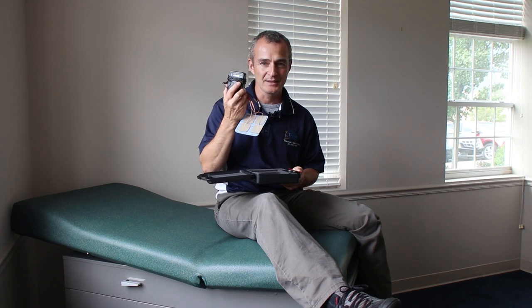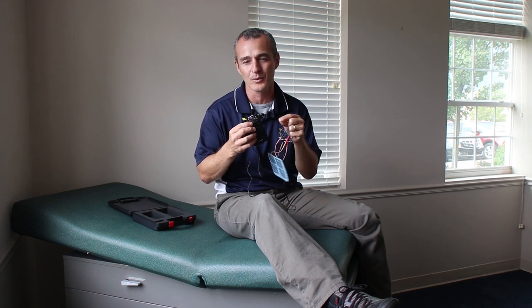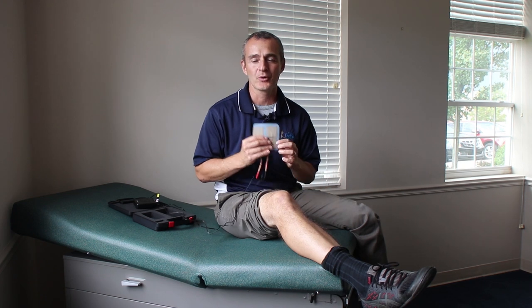A standard TENS unit — I've got other videos showing you how to unpack and set up a brand new TENS unit. This one is already set up for use, so I'm just going to get it out. I advise clients not to pull the connectors apart every time you use the TENS unit because they loosen up and don't work as well. Let's pretend I am the patient and I've had a right total knee replacement. The big disclaimer: if you have a pacemaker or any other kind of cardiac condition, you must consult your cardiologist and your surgeon before using a TENS unit.